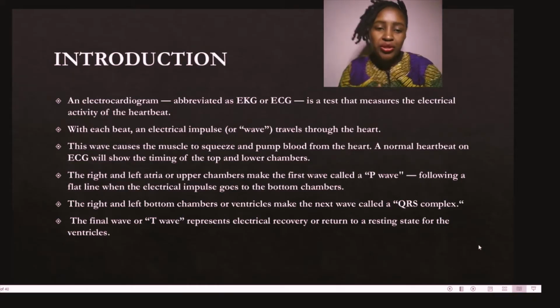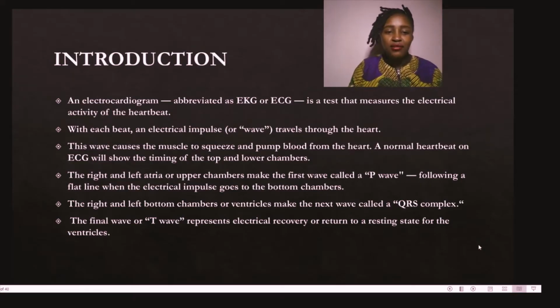So to introduce, an ECG in full is called an electrocardiogram and usually is abbreviated either as EKG or ECG. And this is a test that measures the electrical activity of the heartbeat. With each beat, an electrical impulse or wave travels through the heart. This wave causes the muscle to squeeze and pump out blood from the heart chambers.